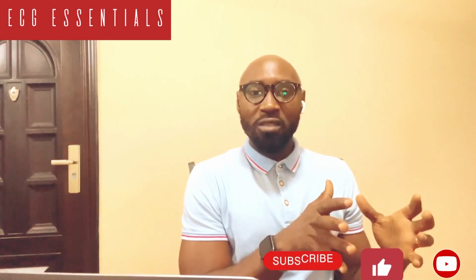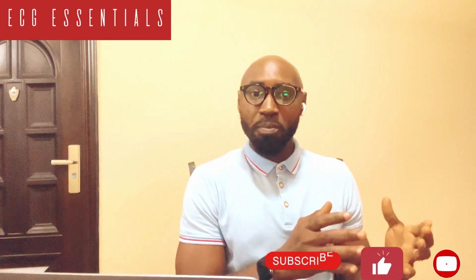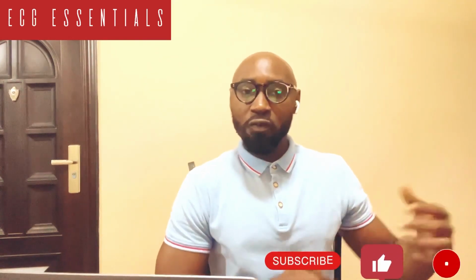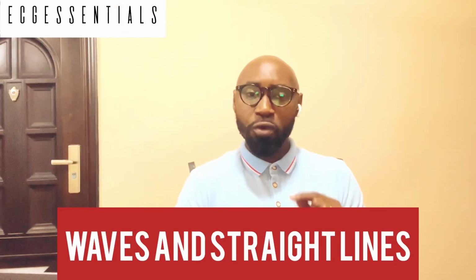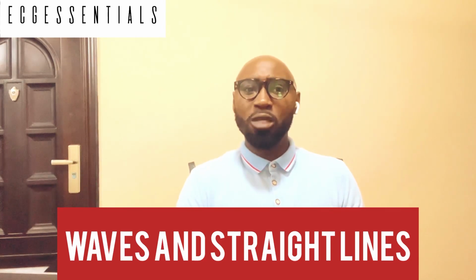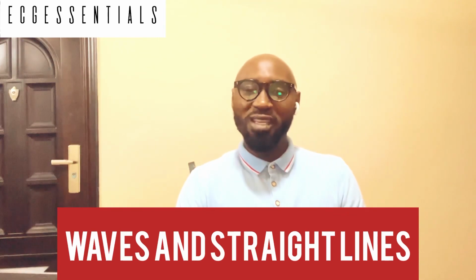In the first part of this second introductory session, we discussed the ECG paper, some of the information we find on the paper, and the relevance of such information. But in this part of the second introductory session, we want to introduce the waves, the various waves we see on the ECG paper, as well as some of the straight lines that we see on the paper, the waves and the straight lines that we see on the paper.